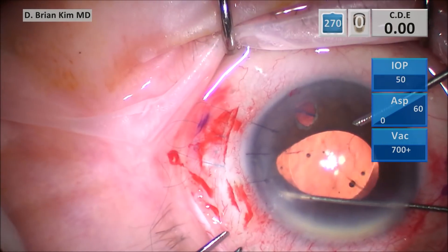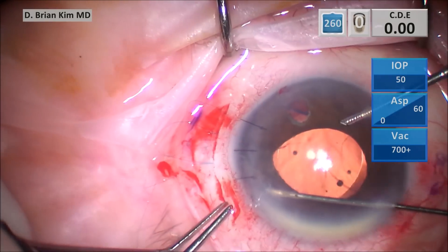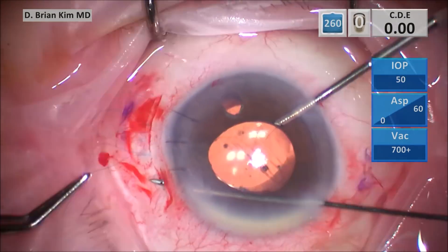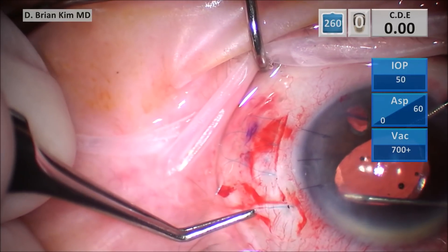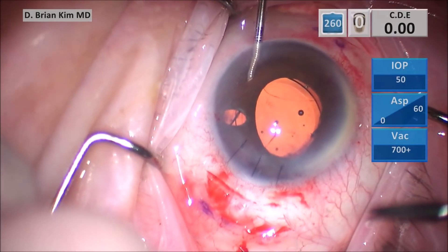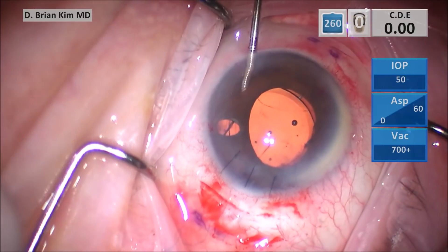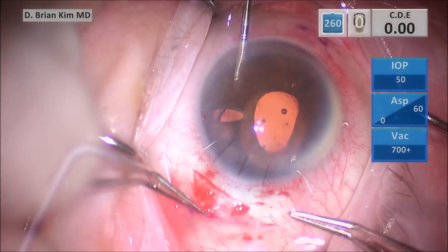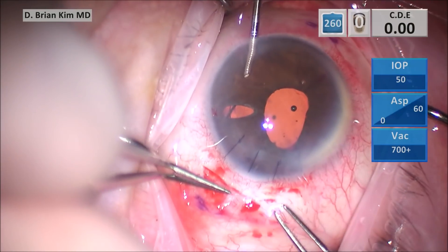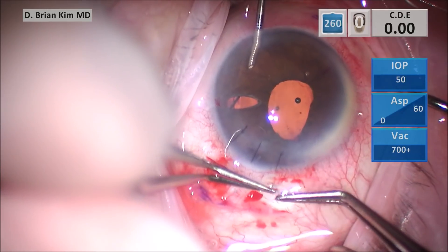You're doing this along the incision because this parallels exactly where the iridodialysis is. Once you have this done across the groove and across the iridodialysis, you'll pull the needle out of the eye, ensuring that the sutures are intact. Then you're going to cut the loops of the suture. By cutting the loops, this enables you to use the free ends of those sutures and tie each suture to the adjacent suture. You're not tying to the loop, because then the suture would just slide back into the wound. You tie the suture free end to the adjacent suture free end, which harnesses the peripheral iris and secures it to the scleral wall.